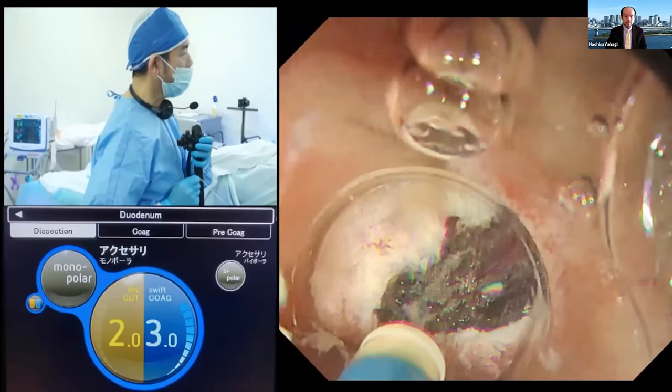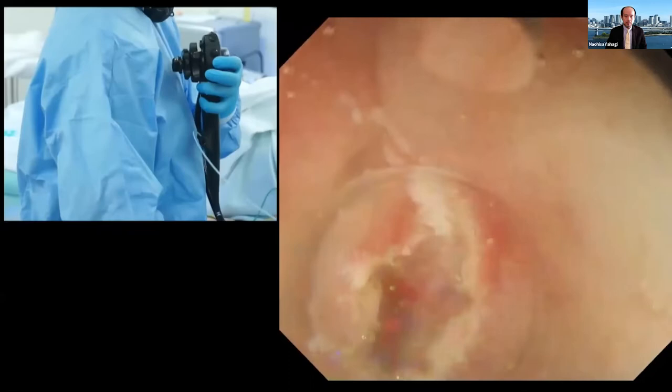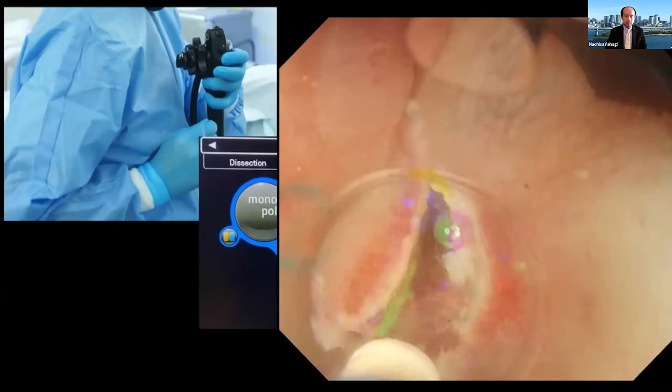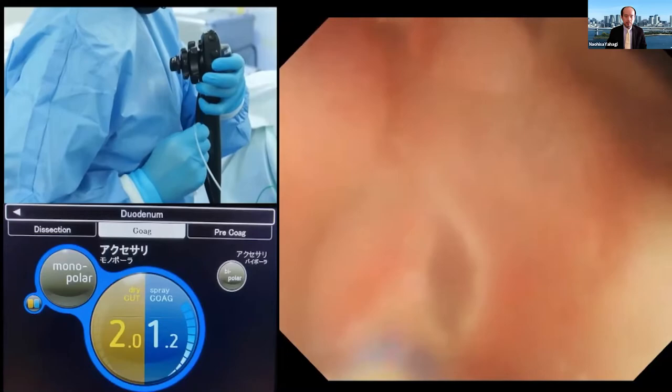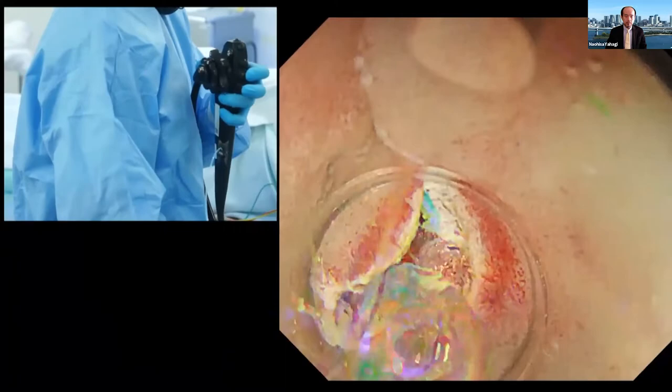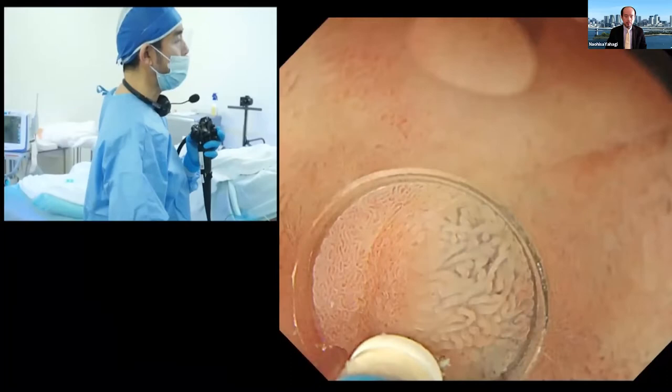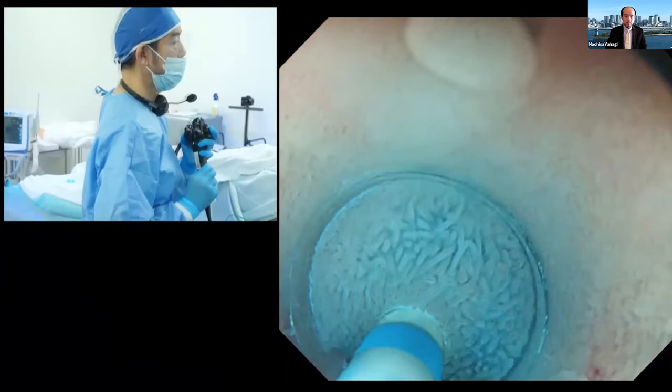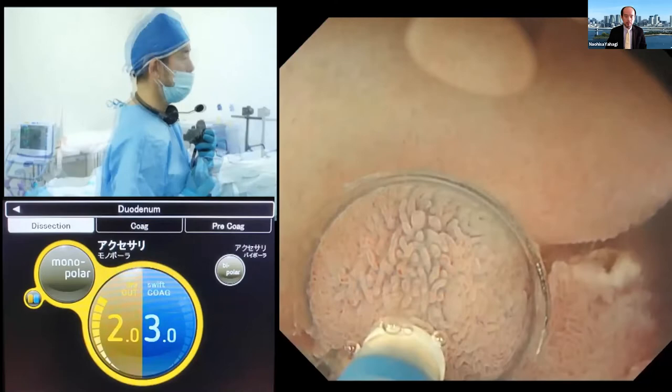Now it's completely stopped. I would like to make a little more submucosal fluid cushion here independently, then quickly start mucosal incision from here, continuing the mucosal incision to connect the incision line to the inner side. Now it's connected.